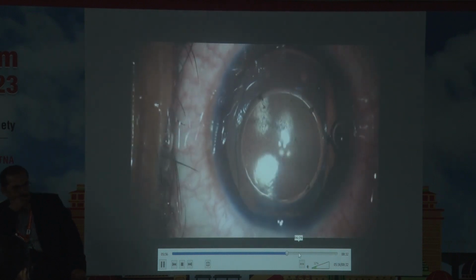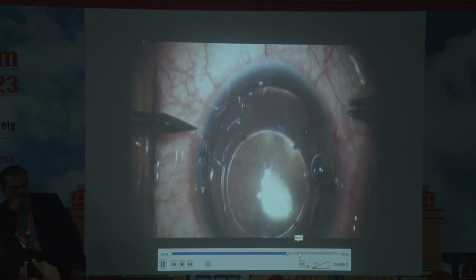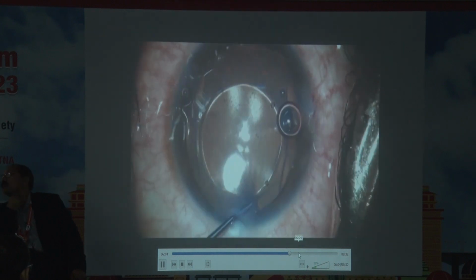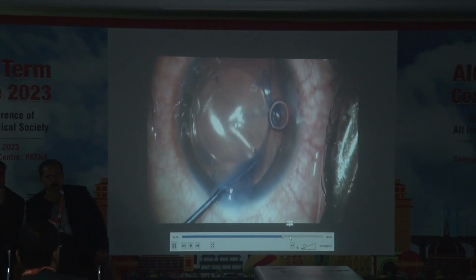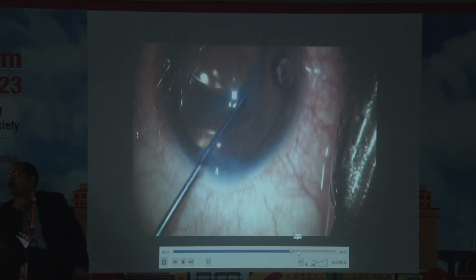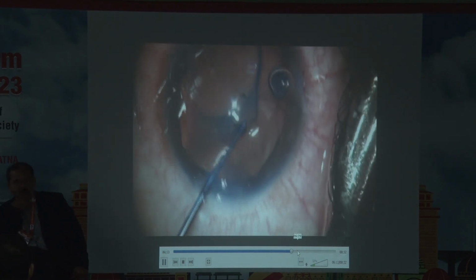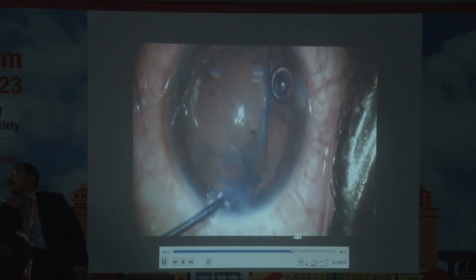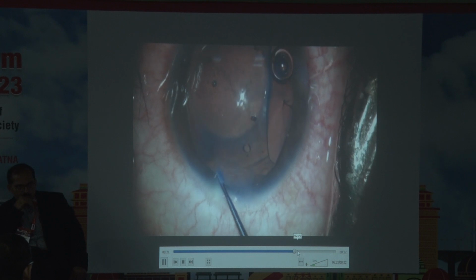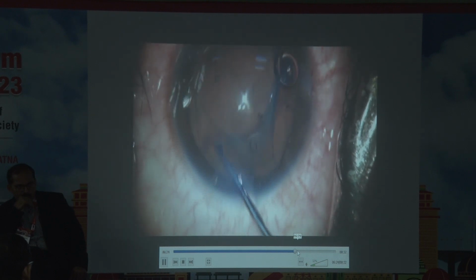PI was done, but probably because of the retained viscoelastic or something, I don't know the reason, she developed this. And she reported after 2.5 days of the pressure. Not necessarily, because the other eye was already operated by SKP. We operated the other eye, she was fine, and she did not even turn up, thinking that this vomiting and all is not related to the phakic IOL.